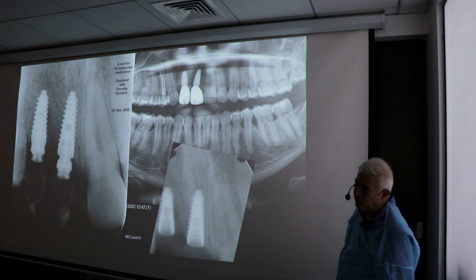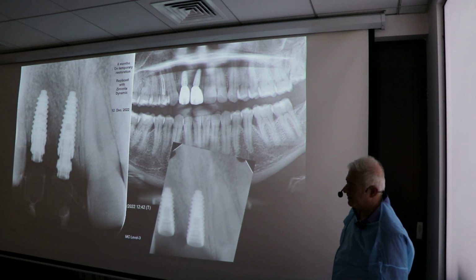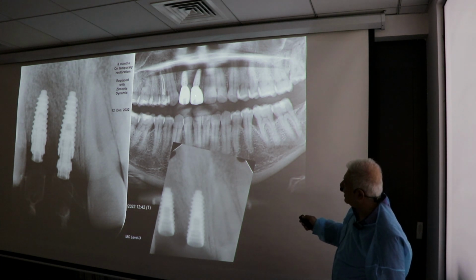Wait. I have 20 minutes of surprise in the end. The restoration 1.5. That's what? The connective tissue. This area, yeah.